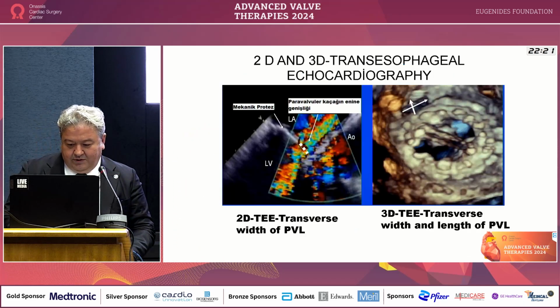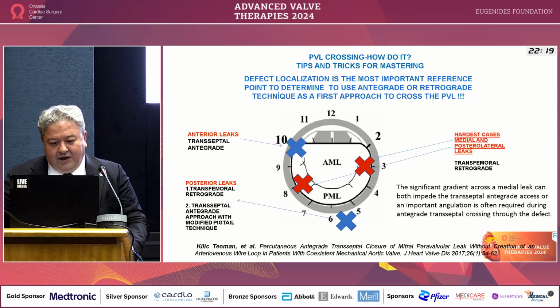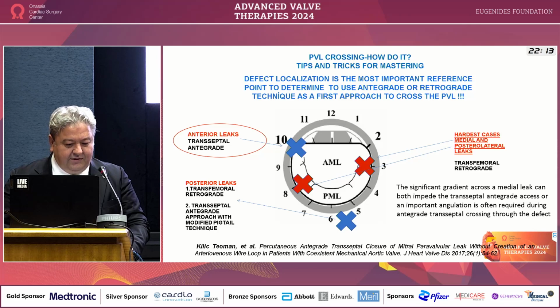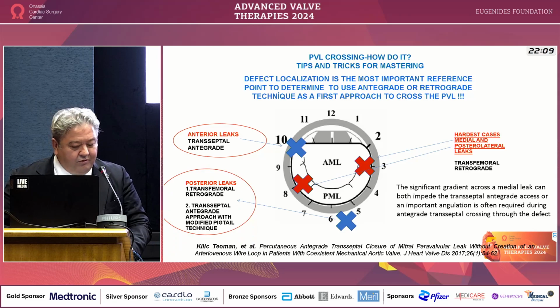So, sorry. What are the tips and tricks for mastering? For the anterior leaks, I always prefer the transeptal antegrade approach. For the posterior leaks, I always prefer to begin with the transfemoral retrograde approach, second, the transeptal antegrade approach with the modified pigtail technique.